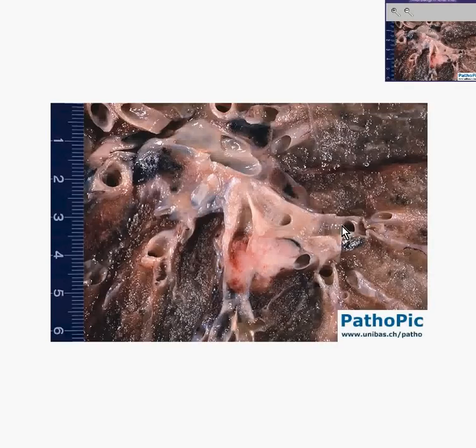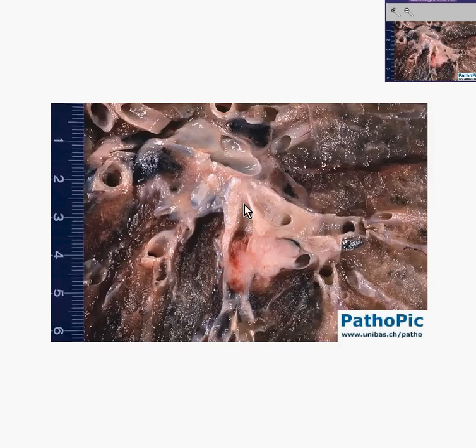Here is a lung. Here you can see parenchyma, anthracotic pigmentation. And here you can see rather good-sized bronchi.